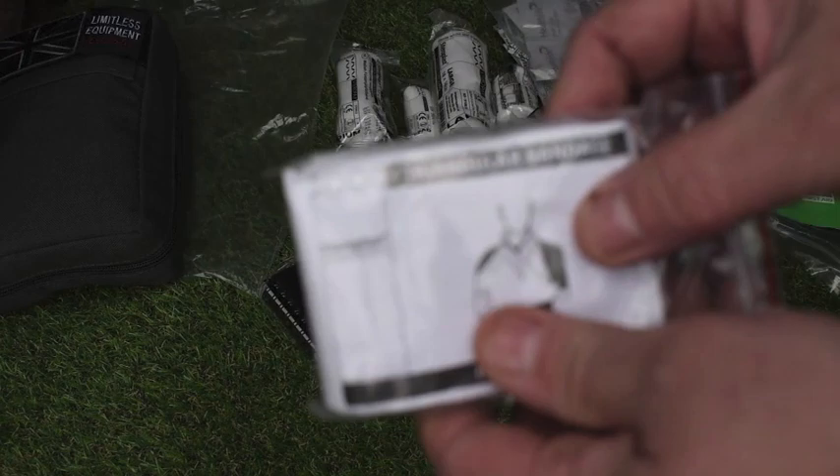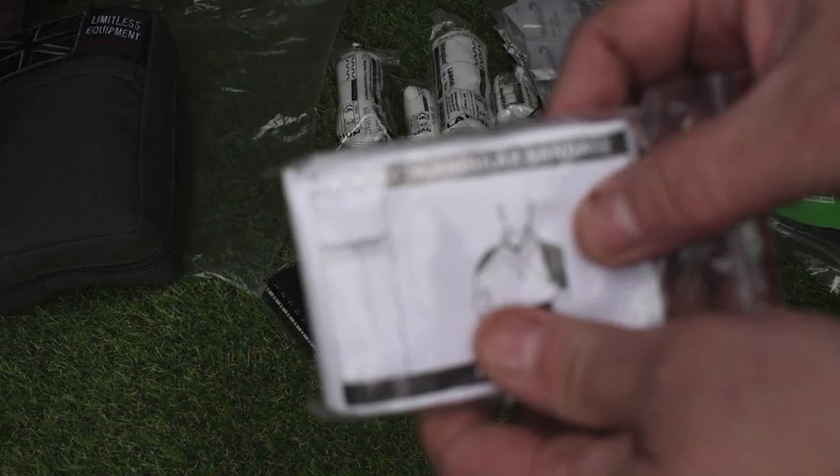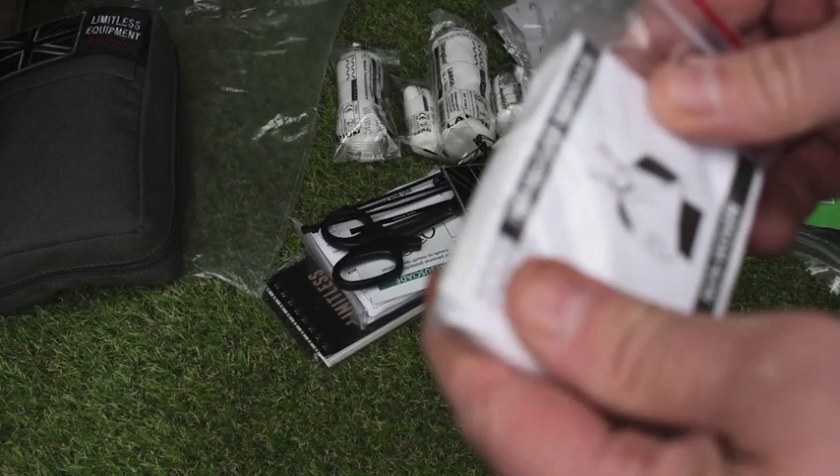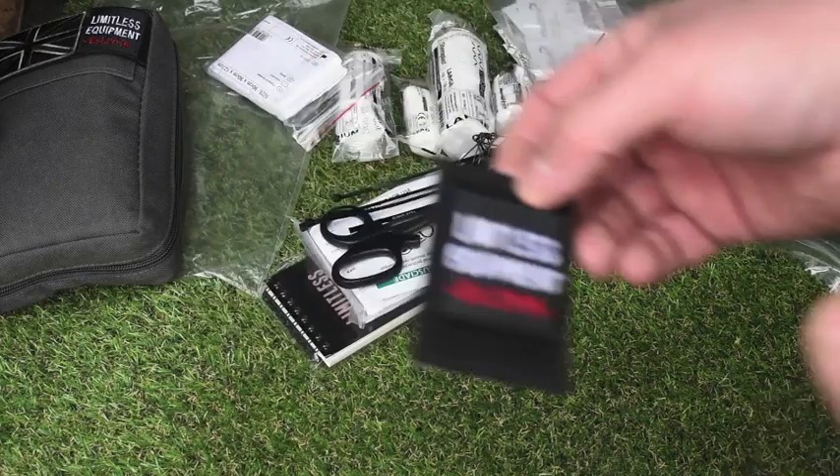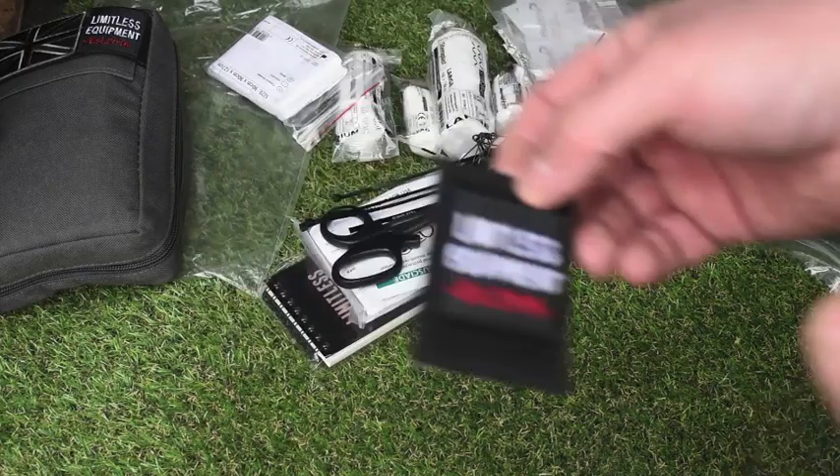There's a triangular bandage for making slings — good just for slinging broken limbs and things like that if you haven't got a splint. The Velcro badge — I thought this was really good, you wouldn't expect that in there. And the Limitless Equipment badge comes in the pack as well. So if you're adding it to your own pouch, you've got a badge you can put on it.